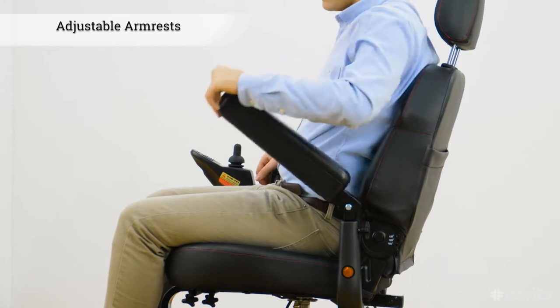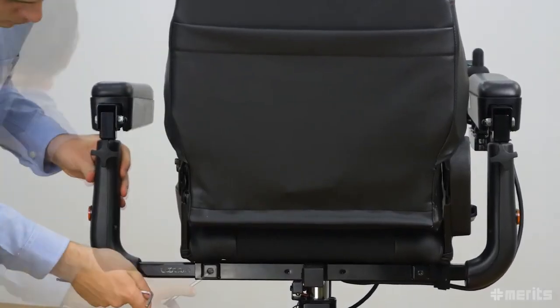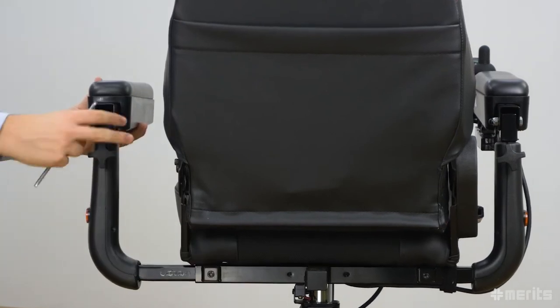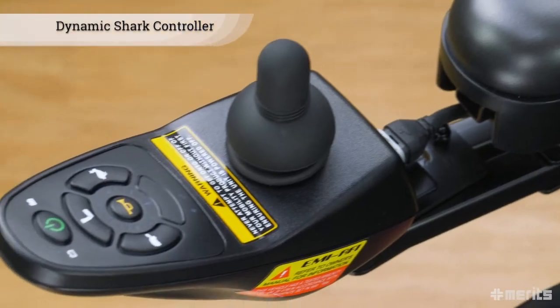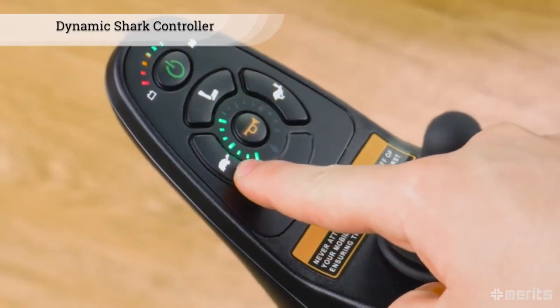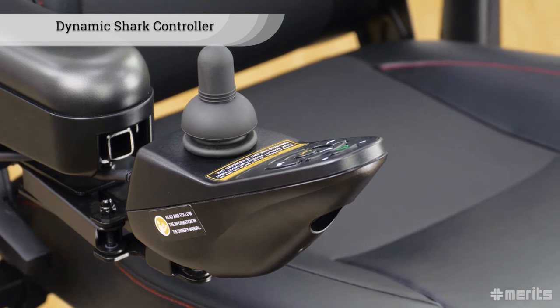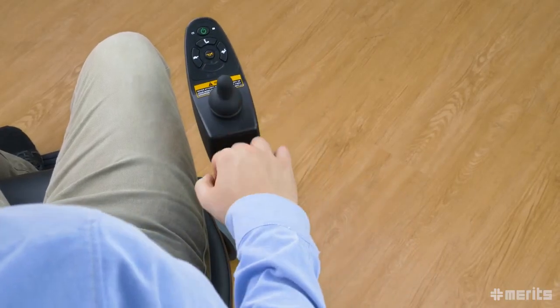The P326D is equipped with armrests that flip up to allow easier access. They can also be adjusted horizontally and vertically according to the rider's preferences. The dynamic shark controller facilitates easy speed adjustments and movement control, and it can be mounted on either side of the seat. Furthermore, the swing-back joystick mount comes standard.